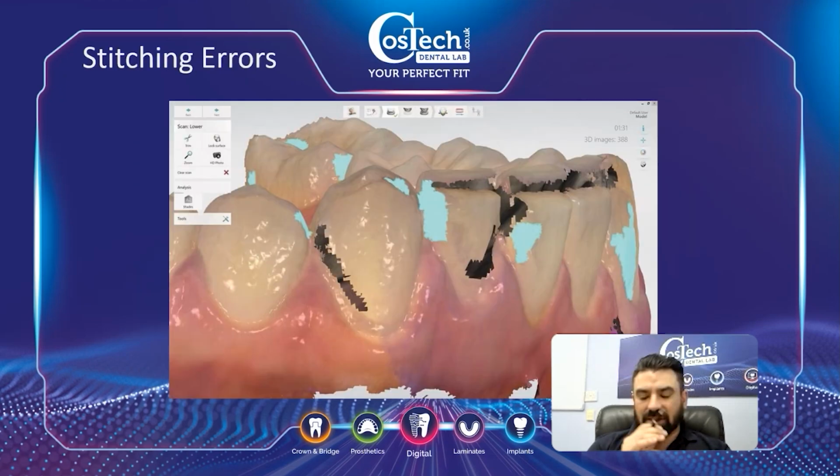Stitching errors. The way to explain it is, if you've got two pieces of paper and you said to the computer, right, put the edges together, the planes can sometimes end up slicing through each other or being open. Getting right on the occlusal table, if they have got teeth, especially on the incisors, make sure that you've got a very good scan. So when you're scanning the flat surfaces, it knows exactly where to place it.